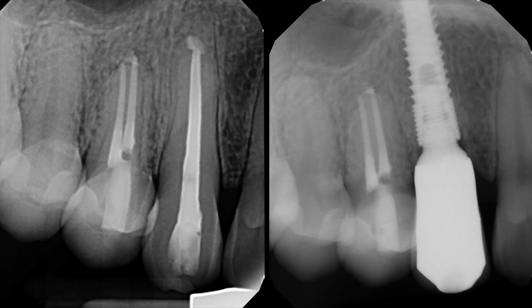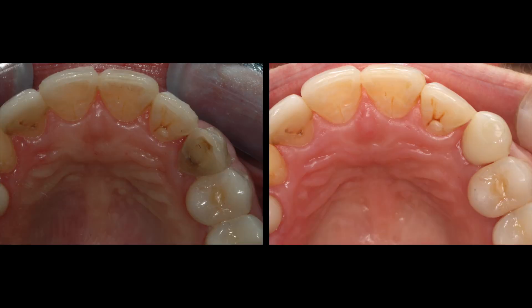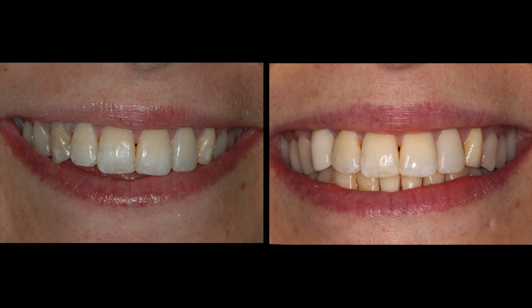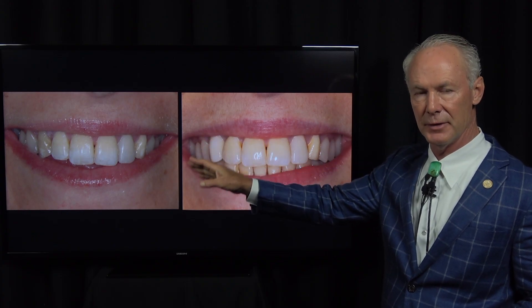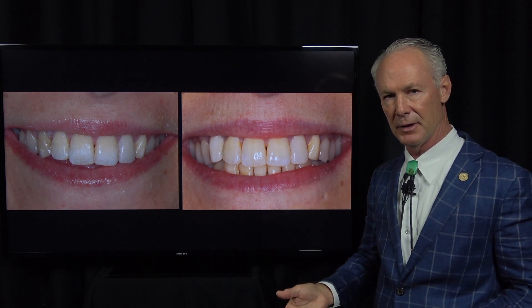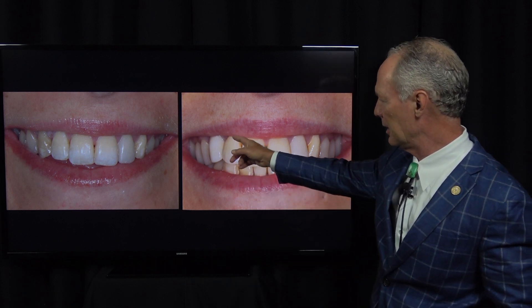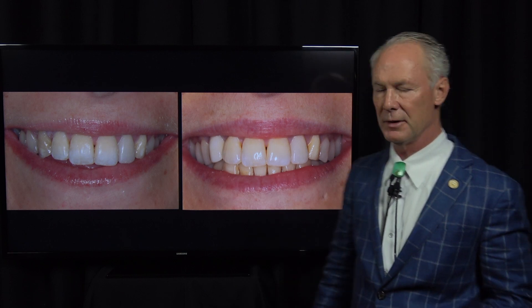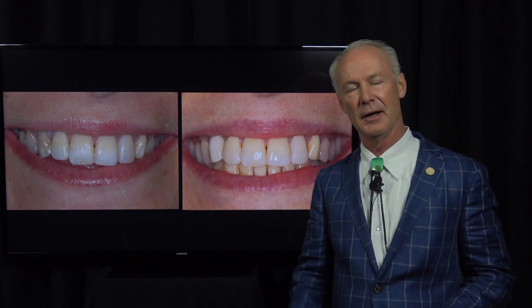That's the second part of this sequence on immediate extraction of a maxillary right cuspid tooth with the Easy Extract system, immediate implant placement, and then fabrication of a screw-retained implant abutment and crown. And that's the Dental Minute. These techniques work, and they work every time.